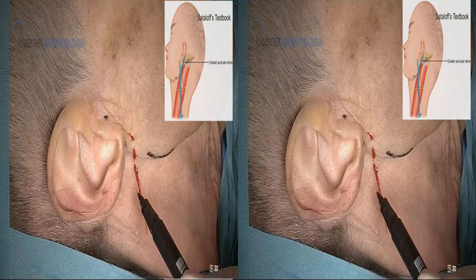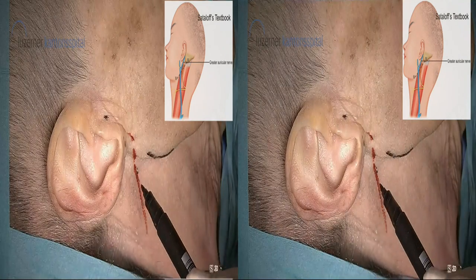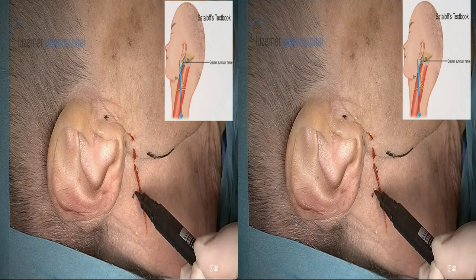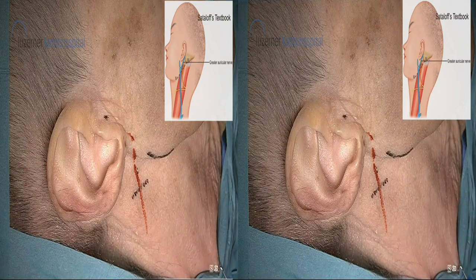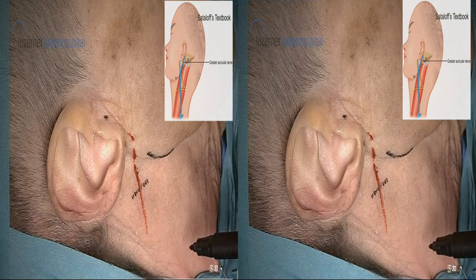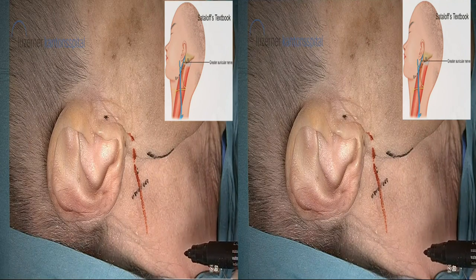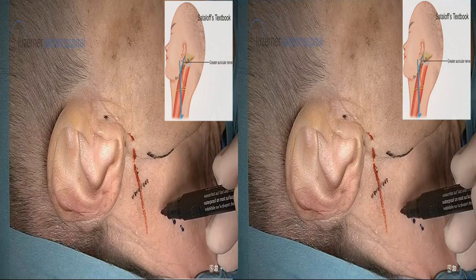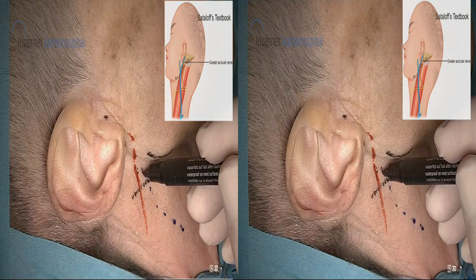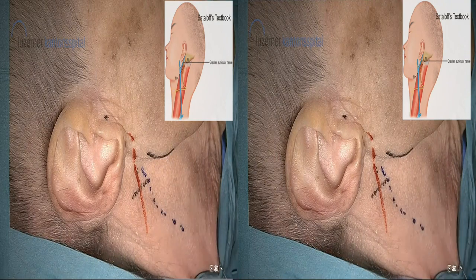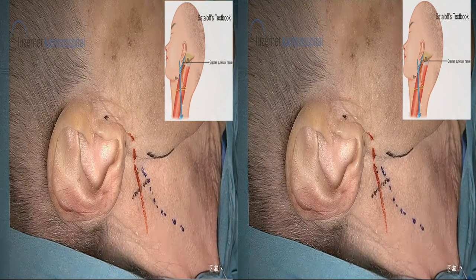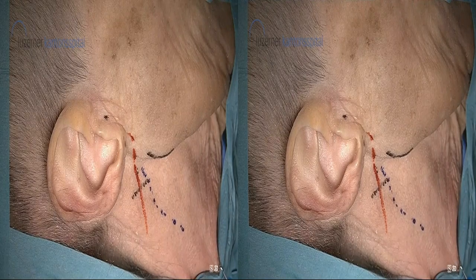But if you just need to find the nerve and you don't do a parotidectomy approach, you may just make a small incision on this side and you will find the nerve underneath. The second landmark for the nerve is the external jugular vein. Here in this specimen it's not shown, but let's assume that this is about the course of the vein. The nerve is, in most instances, just posteriorly to the external jugular vein. In many male patients the vein is easily visible. So these are the two landmarks to find the greater auricular nerve for a nerve graft.